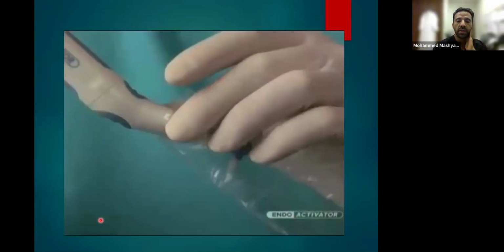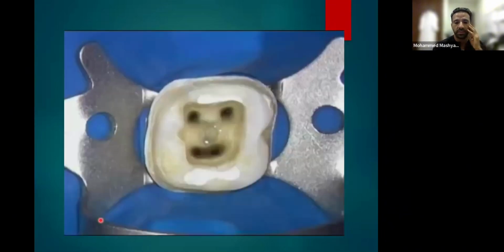So this one, I believe in the market, you have some hydrodynamic phenomenon below the orifice. Let's look at a simulated root canal system. A vibrating tip generates intracanal waves. So look how it does inside.